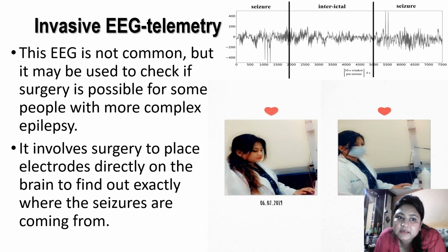Invasive EEG telemetry. This EEG is not common, but it may be used to check if surgery is possible for some people with more complex epilepsy. It involves surgery to place electrodes directly on the brain to find out exactly where the seizures are coming from.